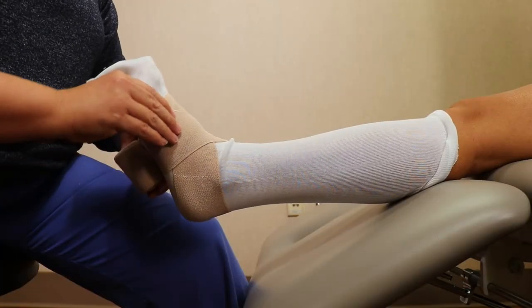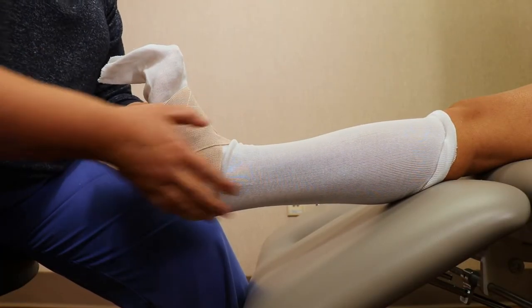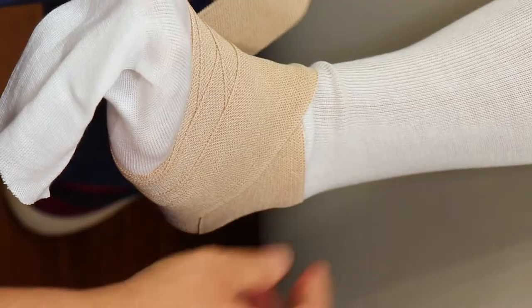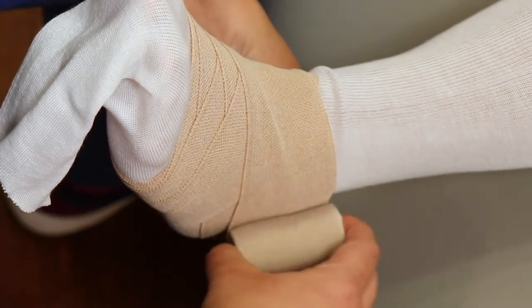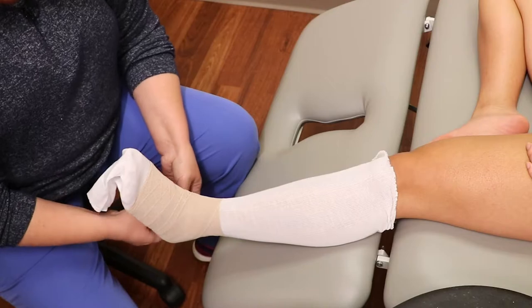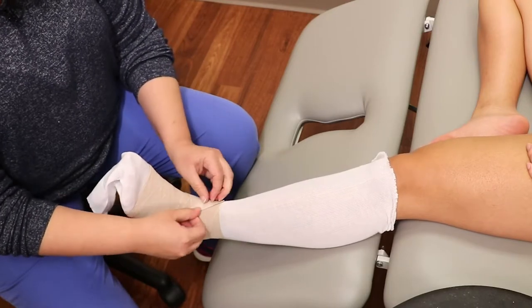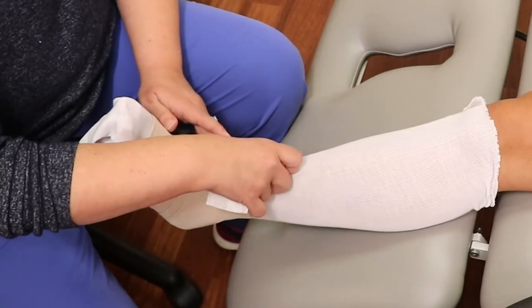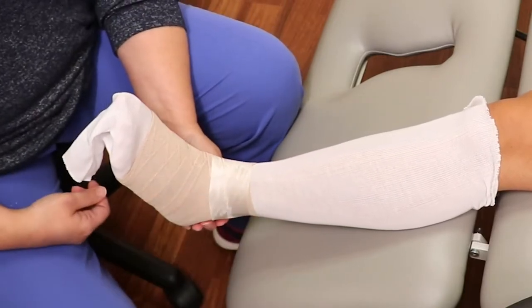Push the foot towards the nose so that your ankle is bent, and continue to make X's with your bandage until you run out of bandage. When you reach the end of the bandage, tape it in place.